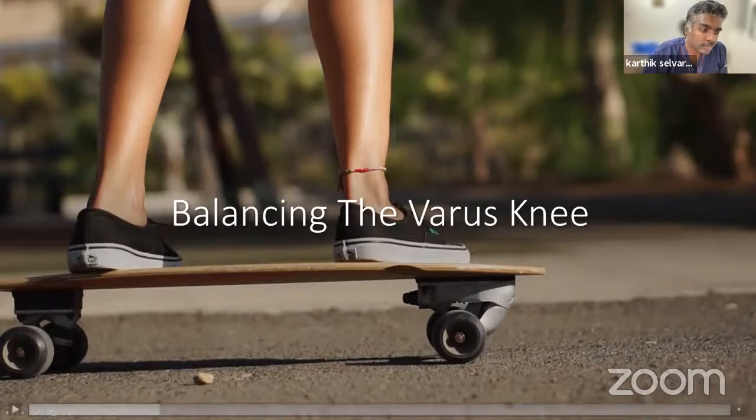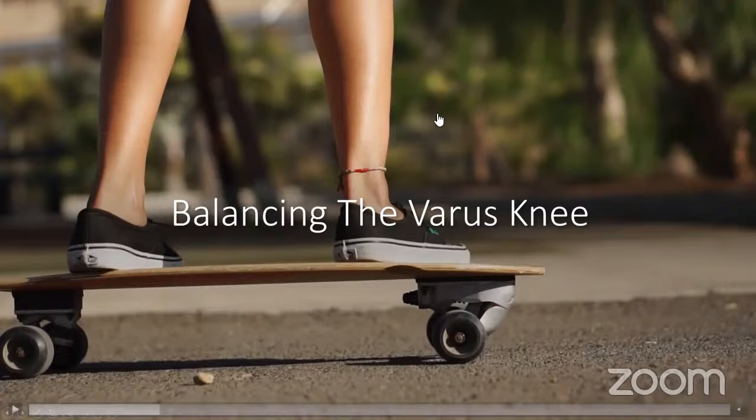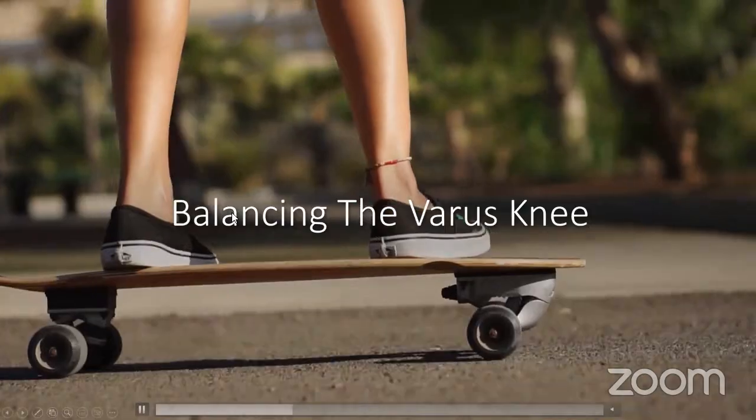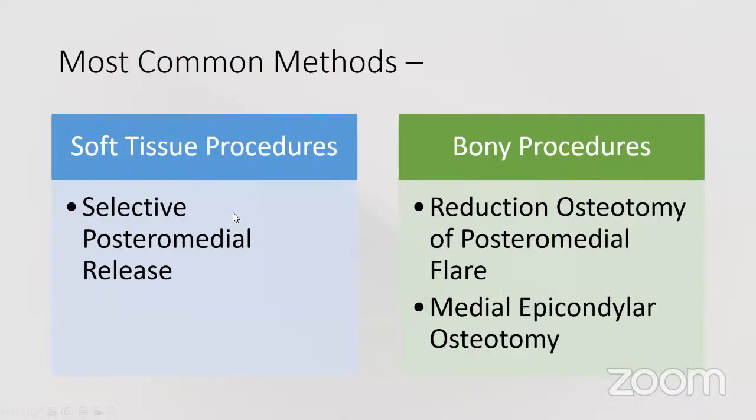Adarsh? Yes, sir. Yeah, please go ahead. Good evening, everyone. We'll see a couple of cases that were done at Case Ortho today to see how we could go ahead and what we have done. The most common methods used for correcting a varus deformity in a TKR are soft tissue procedures, which include the selective posterior-medial release, and bony procedures, which are reduction osteotomy and the medial epicondylar osteotomy.